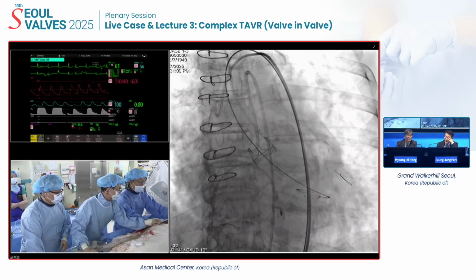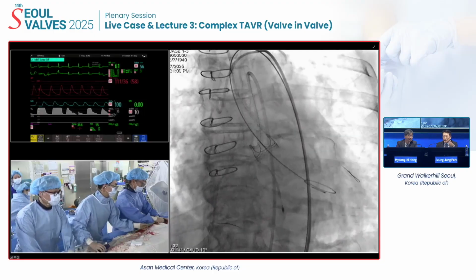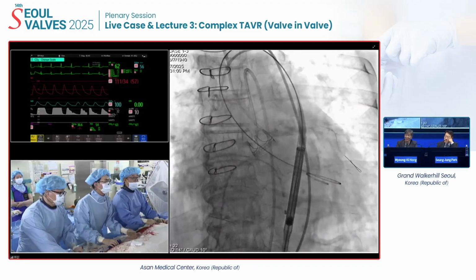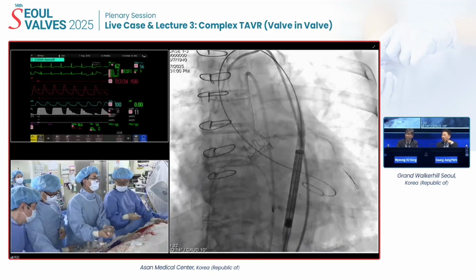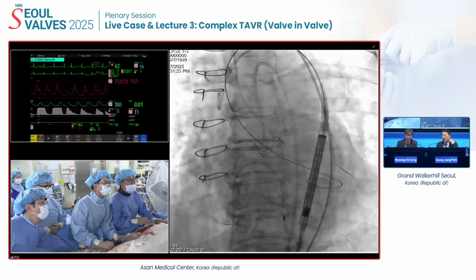There is too much space between the device and the sinus itself, right? Okay, we have great curvature generally. Use a self-expanding valve, make sure here. If the two corners are so low and lateral, you need to put a stent in, it'll not be pretty.